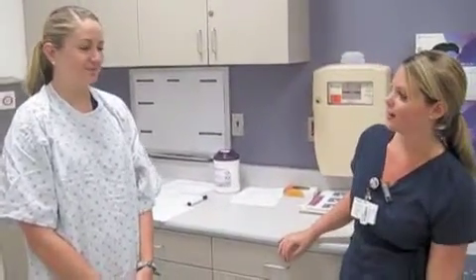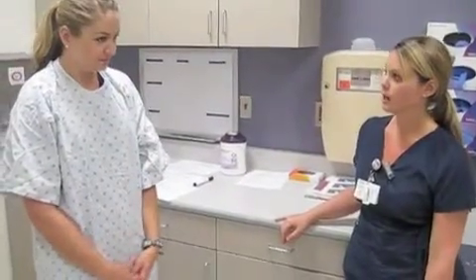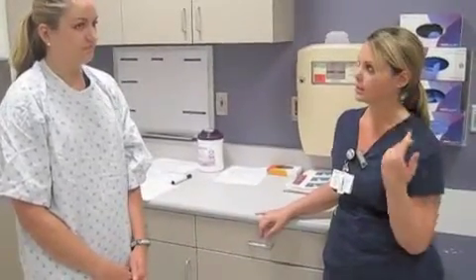Okay, what is your first and last name? Andrea Vick. Okay, and your birth date? 3/16/89. Okay, and why are we doing this today? I fell and I hit my chin right here. Okay, and any chance you could be pregnant? No. Okay, so for this, I would have her remove her earrings and any pins or clips in her hair.